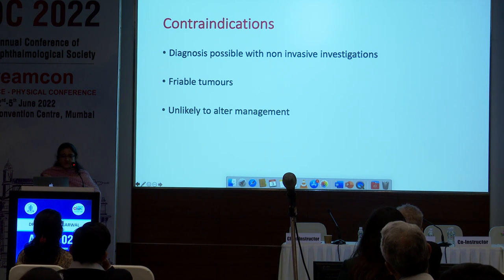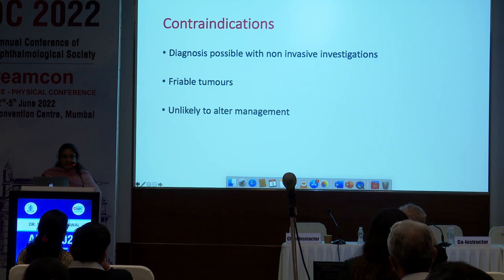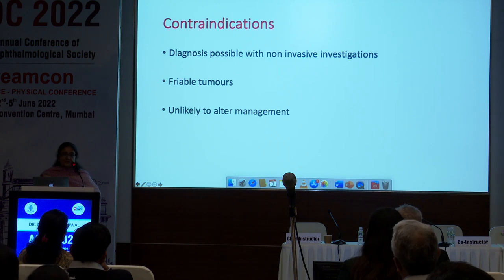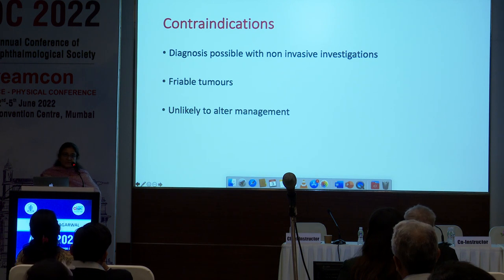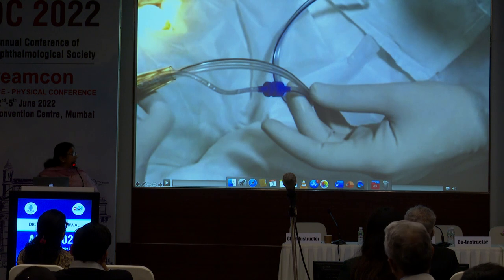As far as the contraindications are concerned, if you can make the diagnosis with a non-invasive investigation, obviously you are going to prefer that to doing any surgical intervention. Friable tumors, again, it may not be very useful and unlikely to alter the management. So if you decide that you are going to treat this patient with steroids, and the patient is showing a response, then there's no point disturbing the management, because in any case, you're not going to be altering your management. Now, this is a short video.